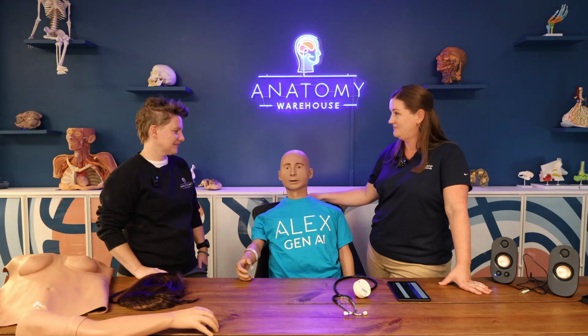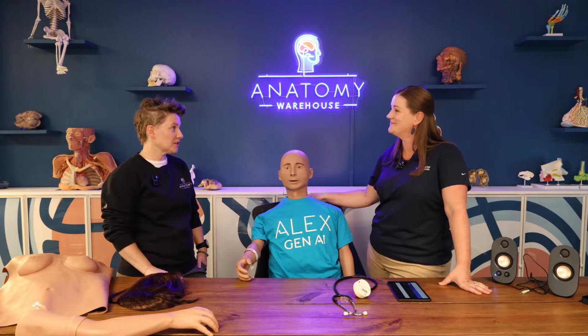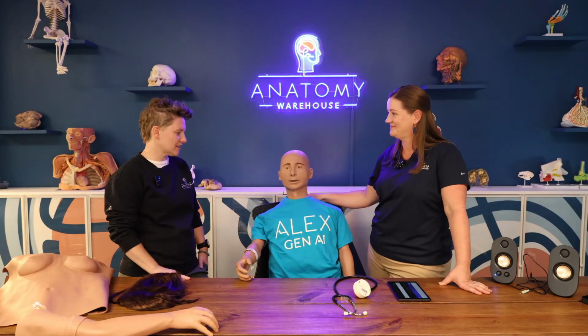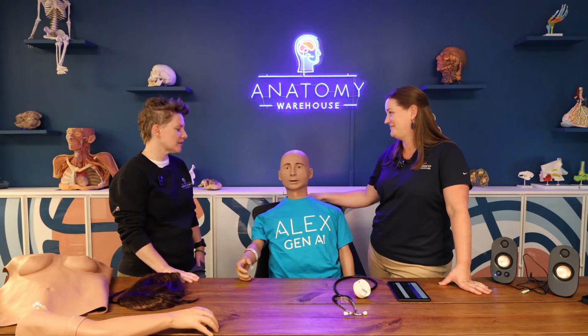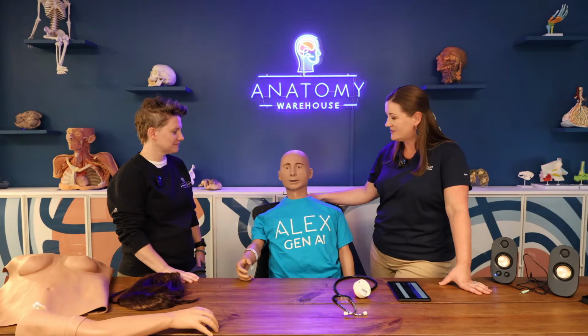Yeah, I mean, we've worked with you guys for years. You've always really stood behind the product, and it's cool that Alex is keeping up with that standard of care and quality that you guys have always been known for. Yeah, for sure. He's a great simulator.